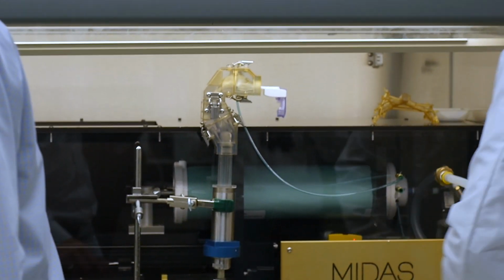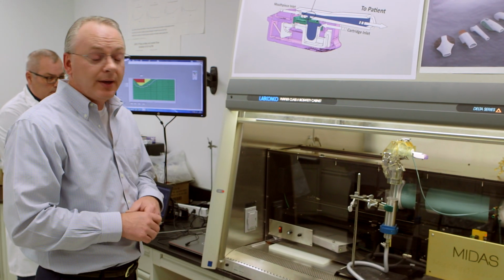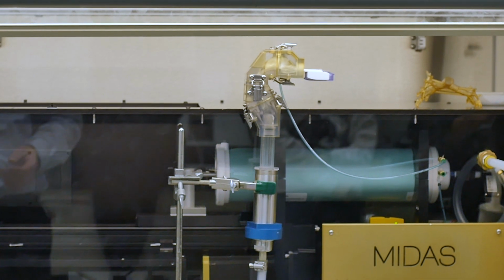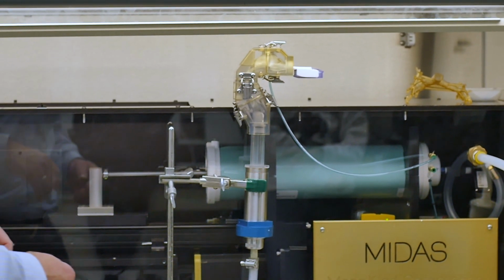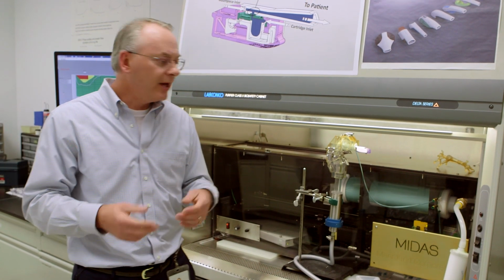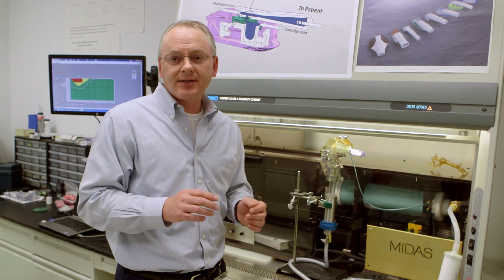It's important to notice in the first probably 500 milliseconds of the inhalation effort, the powder has traversed the whole airway and is presented to the lung. Try cycling it again. What's interesting here is that in the 500 milliseconds, the powder activity is over. And importantly, it only takes about 350 to 500 milliliters of air. In a human lung, you have much more capacity to inhale. We're delivering the powder very early in the onset of the inhalation effort.